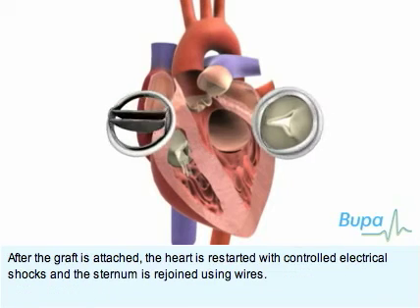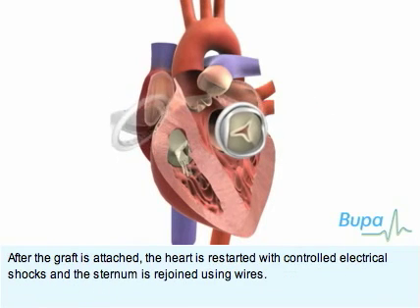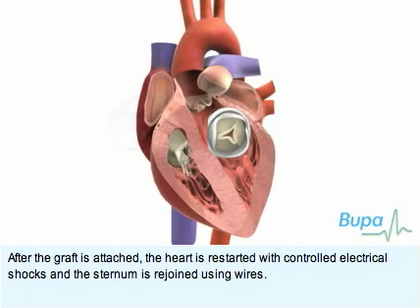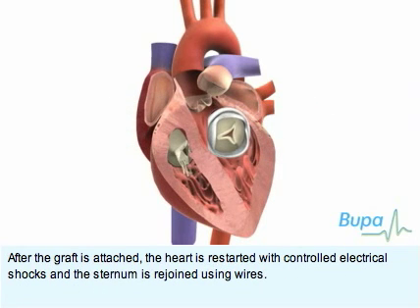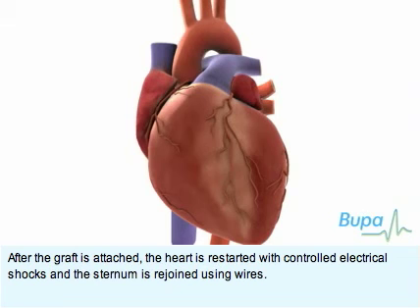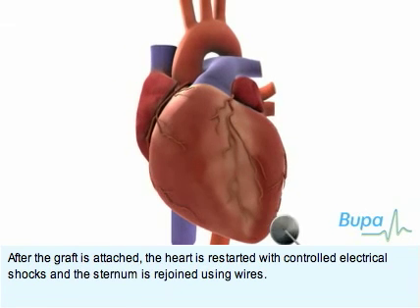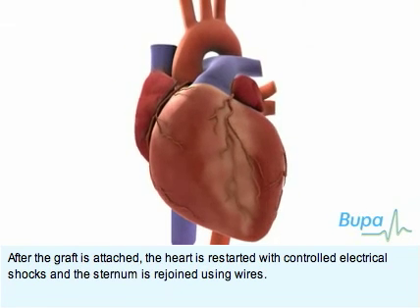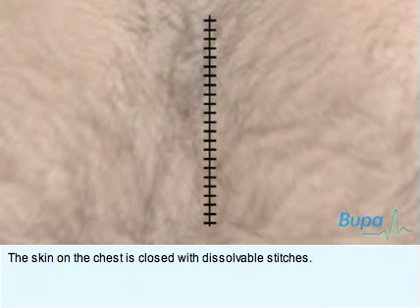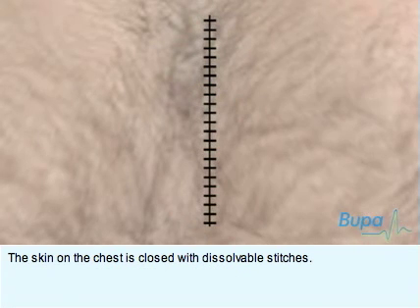After the graft is attached, the heart is restarted with controlled electrical shocks, and the sternum is rejoined using wires. The skin on the chest is closed with dissolvable stitches.